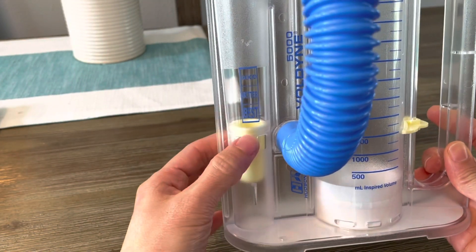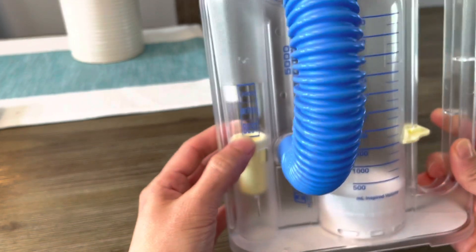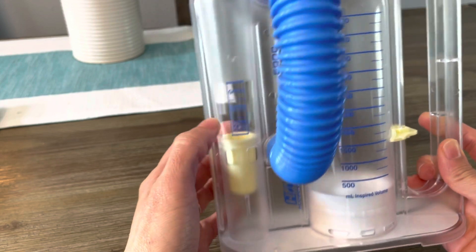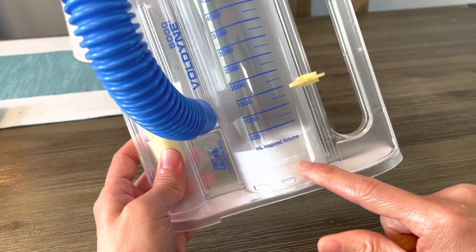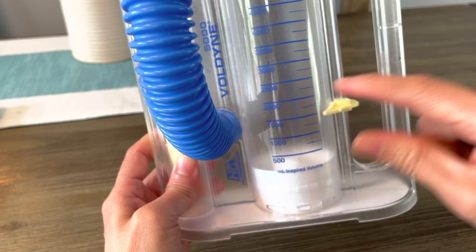On this side you have the indicator — it will go up and tell you if you're doing it best, better, or good. And right here you have this piston that will go up as well when you're doing the exercise.